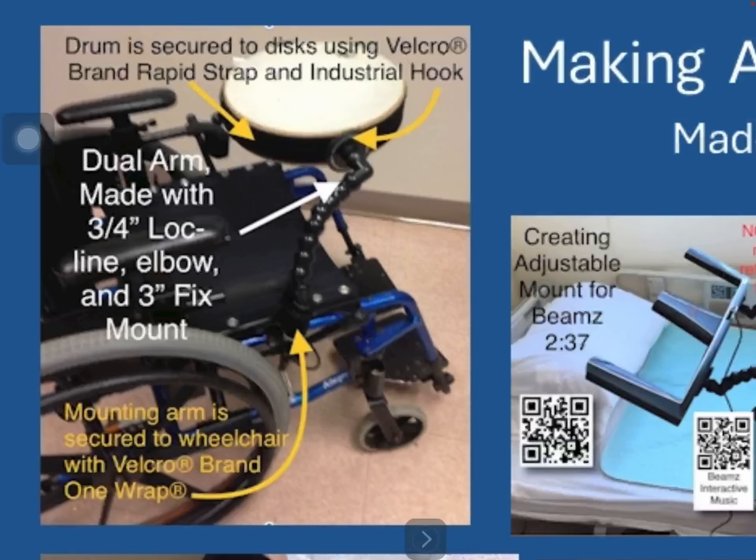The text on this image says the drum is secured to the disc using Velcro brand rapid strap and industrial hook. The dual arm is made with 3/4 inch lock line, elbow, and 3 inch fixed mount. An arrow points to where the mounting arm is secured to the wheelchair with Velcro brand One Wrap.